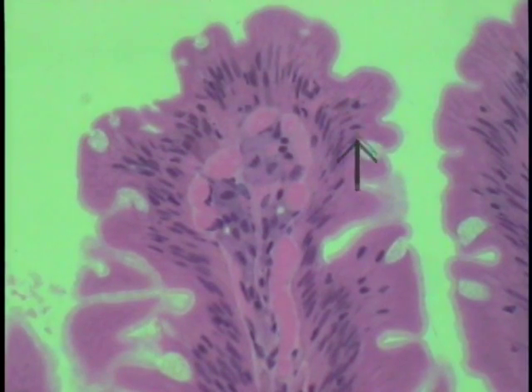Here lies the intestinal epithelium. Recall that this is a simple columnar epithelium despite this rather obtuse section, and one should be able to visualize quite well that microvillus border on the enterocytes. Also shown scattered, but not well, are a few profiles of goblet cells, so this indeed is a heterogeneous type of epithelium. It'll also contain other cell types, such as enteroendocrine and some other cell types that may be demonstrated later.